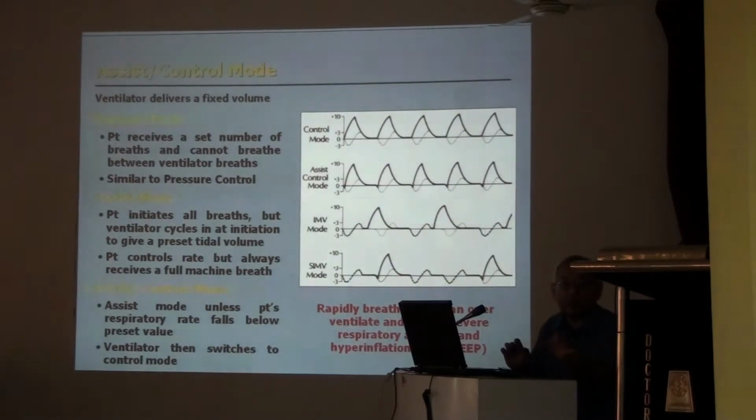Till now I was advocating for IMV. Now I am telling you IMV is not good for me. Why? Because it is not sensing my respiration. So comes SIMV. The same mandatory breath will be delivered when I have started taking the next breath. It will sense and it will deliver. Basically both are the same, IMV and SIMV. Only this is asynchronous, this is synchronous.